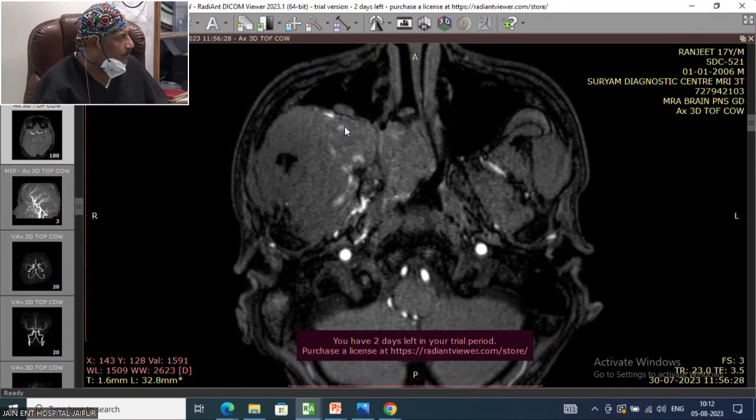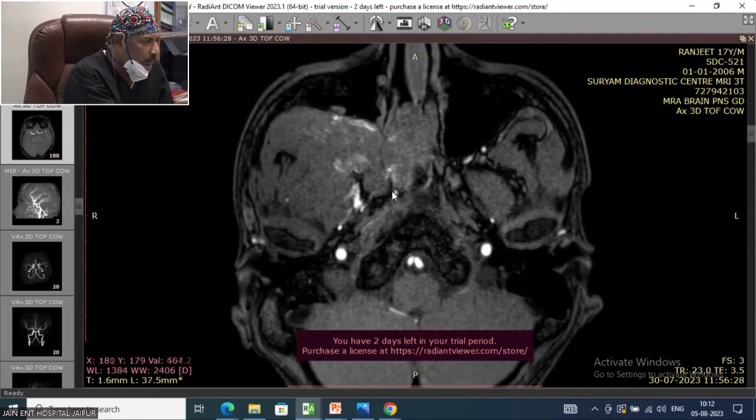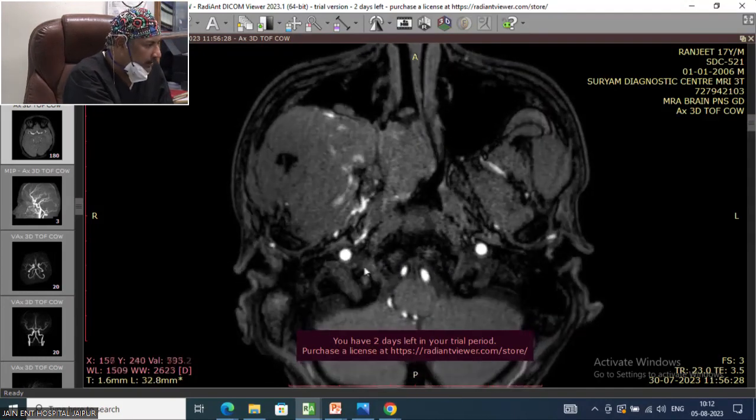Yes, if you take the help of embolization, you can embolize the middle meningeal to further reduce the vascularity. We are going to encounter some bleeding, but we'll manage it with our other tools, the Surgicel. We may have to use Surgiflo or something like that, but the massive ramification is from the internal maxillary. So once we take the maxillary in control, we'll be able to reduce the bleeding to the tumor significantly. This is how we work.